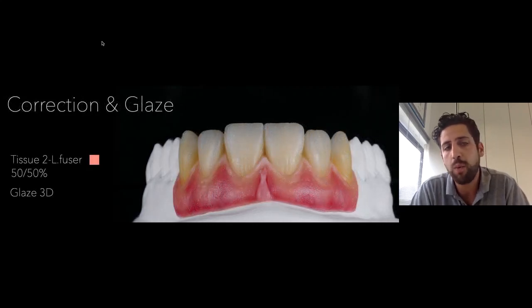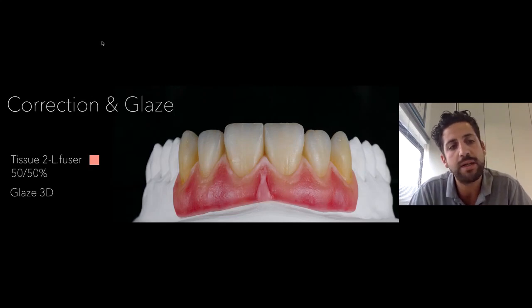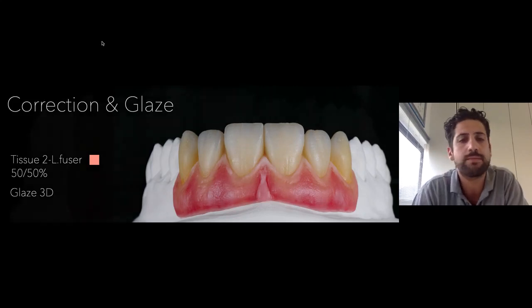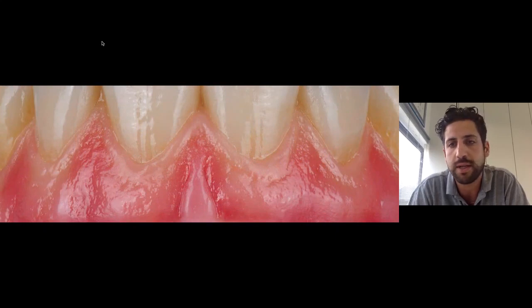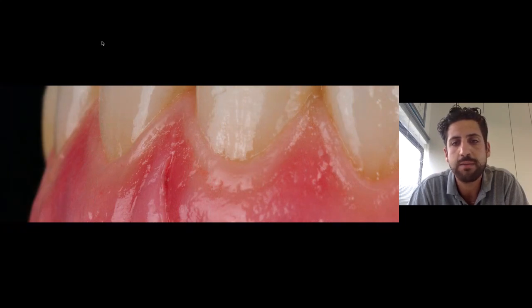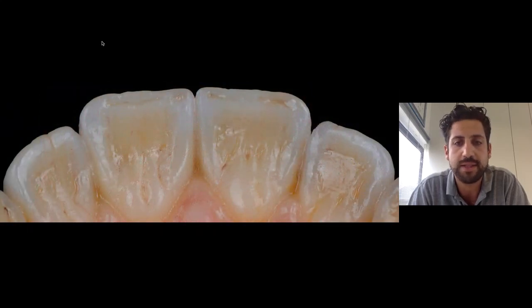After the second bake, maybe we can make the glaze to close all the porosity of the gingiva, and then we put some little characterization in the free gingiva, just in the neck, mixing tissue 2 and low fusion dentin, 50-50, to make the correction. And this is the result after the hand polishing. This is a nice picture closer. Profile. And this is the palatal side.